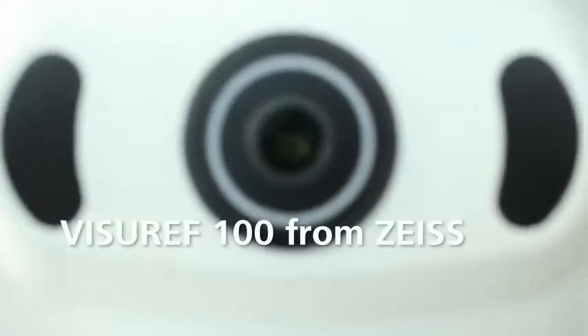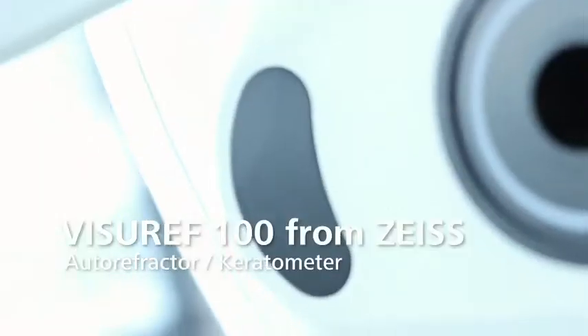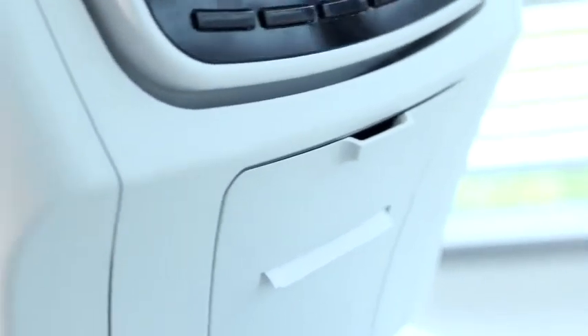With the Viseref 100 from Zeiss, you can quickly and reliably perform accurate objective refraction and increase your office productivity. It can be operated simply and intuitively with little training. Focusing on essential performance, the Zeiss Viseref 100 has been designed with simplicity and affordability in mind.